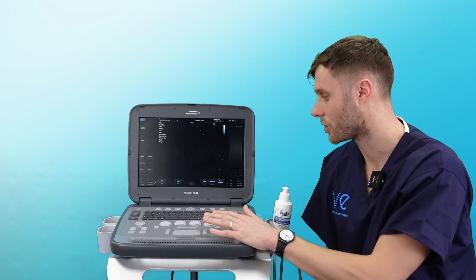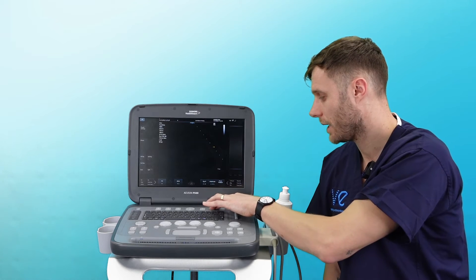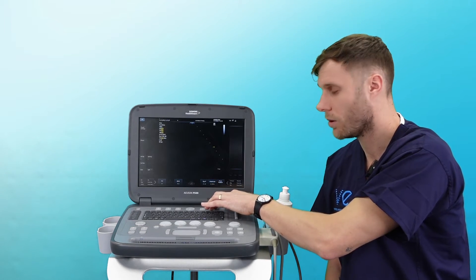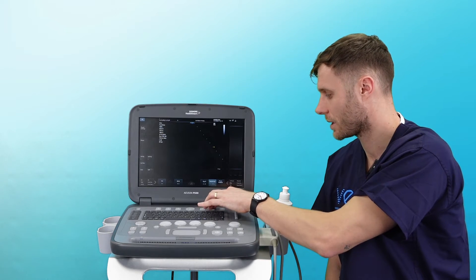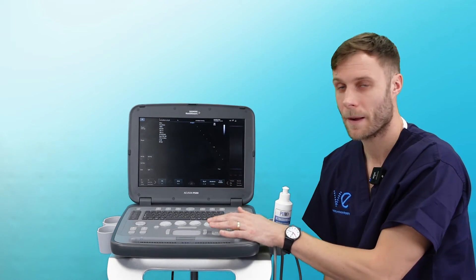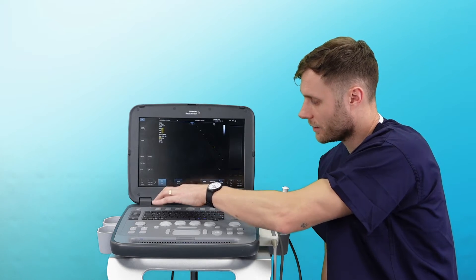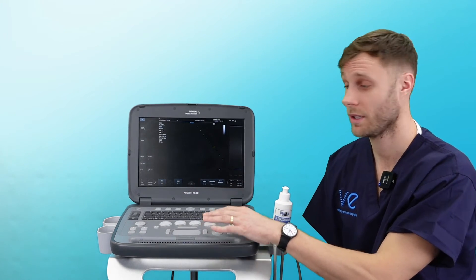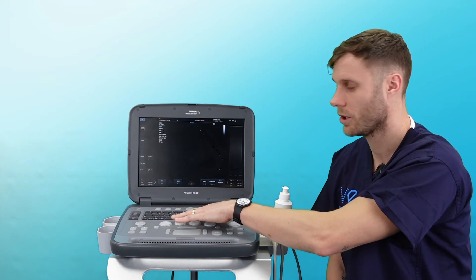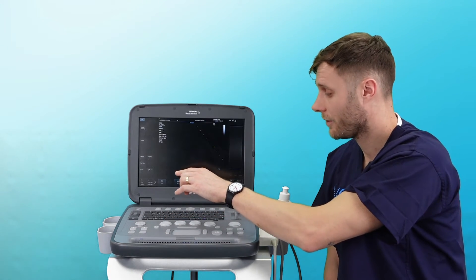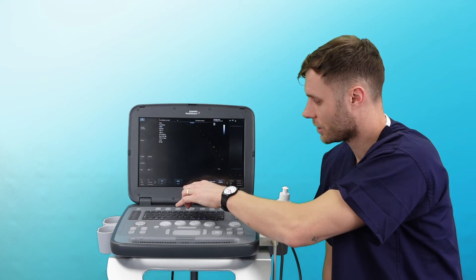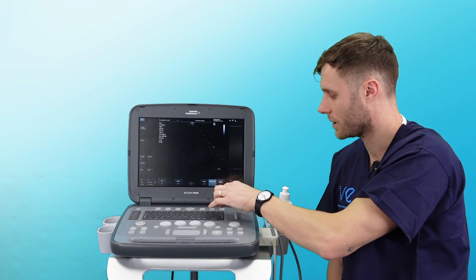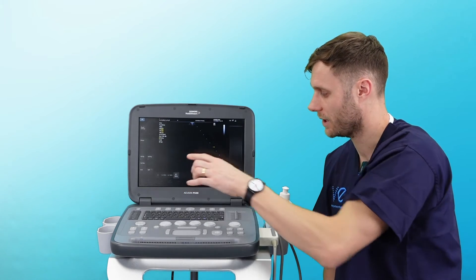These are the basic controls. You have your frequency control up here — if you're not getting enough penetration you can drop your frequency, or if you want better resolution on your images, increase the frequency. You also have tissue harmonics here, so you can flick tissue harmonics on and off. It's worth noting the P500 has a control panel but it's also touchscreen, so anything you can do on the control panel you can also just touch the screen — to turn harmonics off just click THI, or to change the frequency you can use the touchscreen.